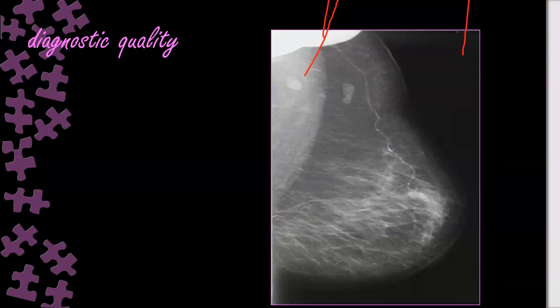If you are not sleeping, show me what is wrong in this image. This is mediolateral oblique. Where is the fold? The skin, not the nipple also. No, it is there. I could see it, the skin. All the skin? Yeah, throughout the skin, I could see it. Go throughout the image. Check. I'm sure if you are not sleeping, you will pick the error like that.